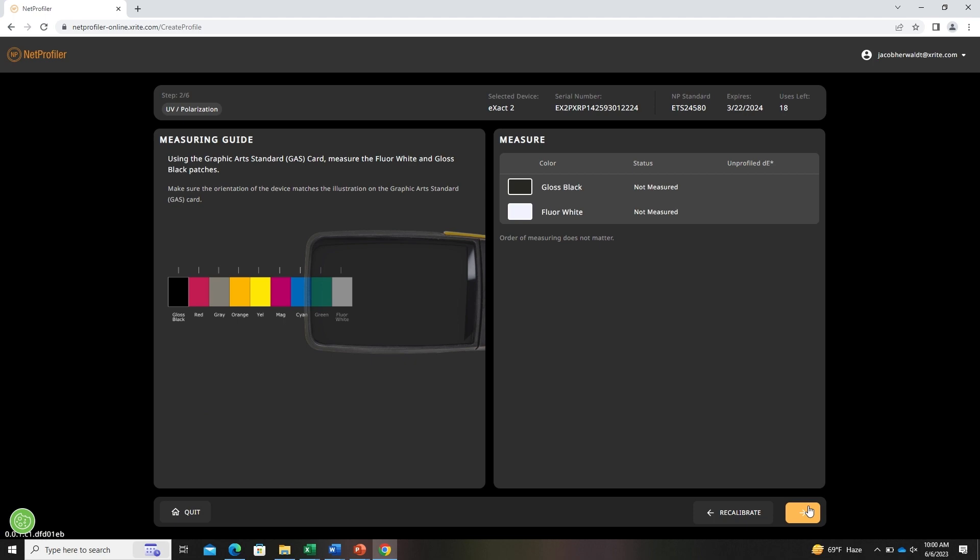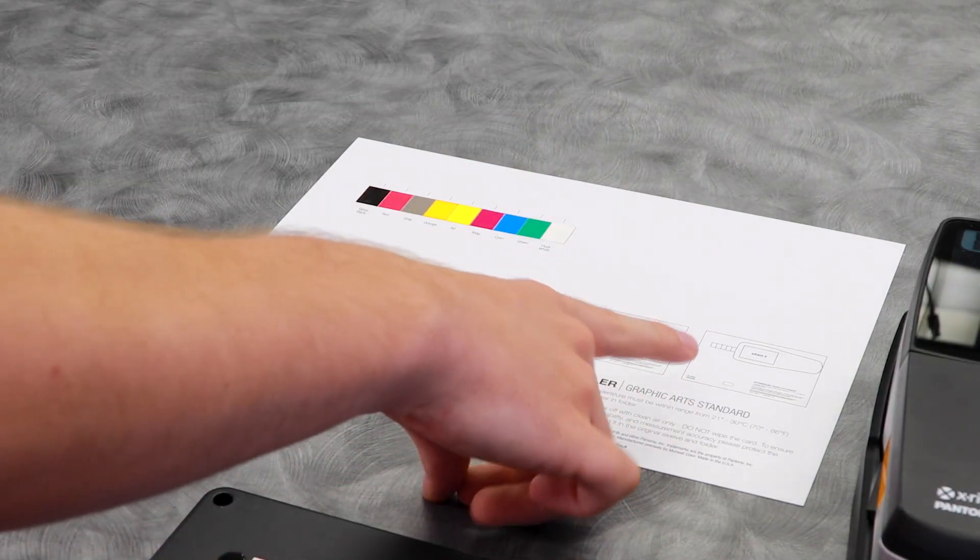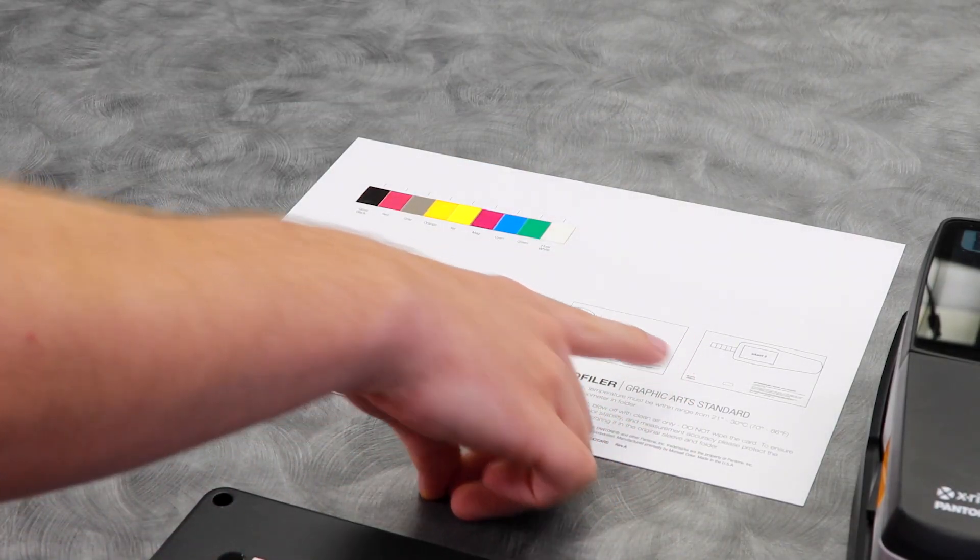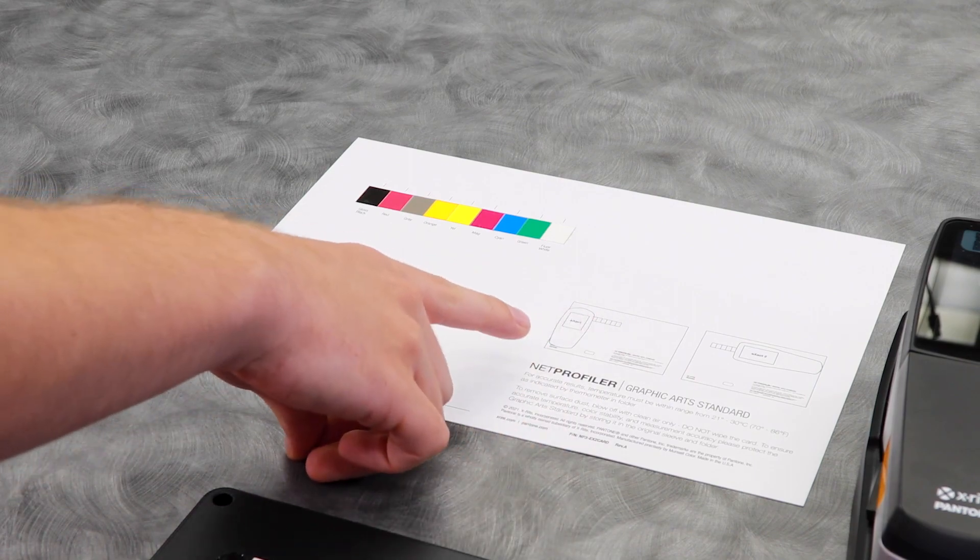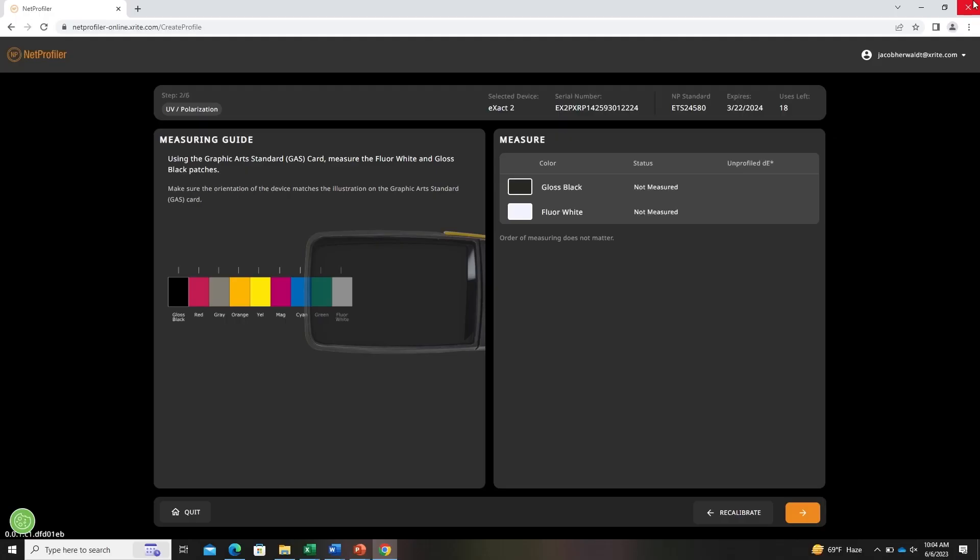Now in measuring standards, make sure that the orientation of the device matches what's indicated on the card. We'll measure the white and the black. Here the order of measuring the colors does not matter. If a measurement that you take is outside of the tolerance, that measurement will fail and a prompt will come up on screen giving you tips on how to improve that measurement.